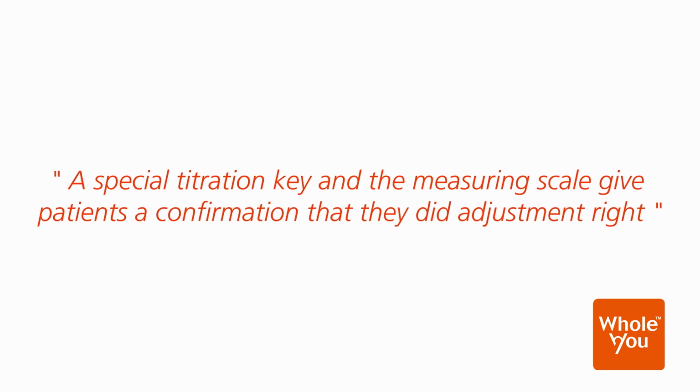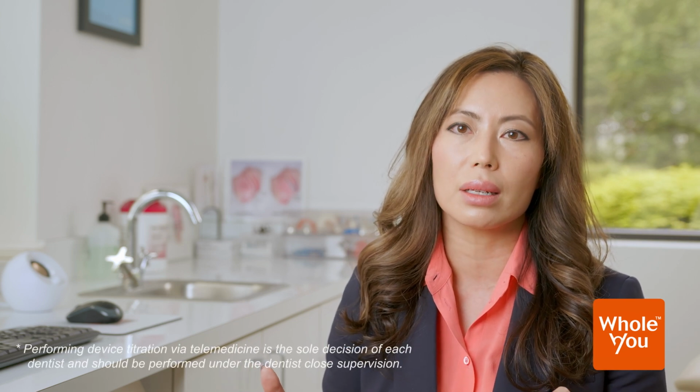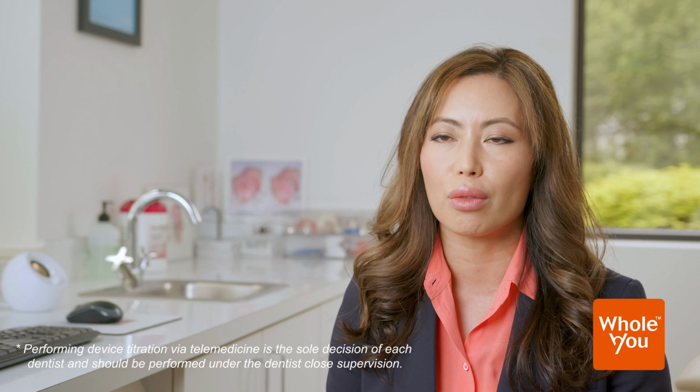When I give it to the patient, I look at multiple things. So the material itself, the construction of the appliance itself, I'm really happy with. The strength of it, the thickness of it, and specifically the AT gearing mechanism, I've been happy with so far. This is more intuitive. The directions are the same, and that's the big thing that patients get confused about, which direction to adjust, and this one makes it easier for a lot of patients.